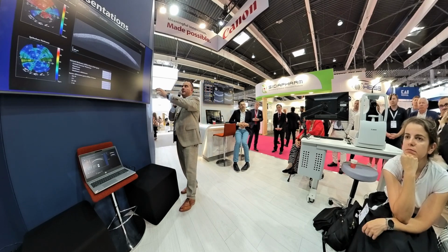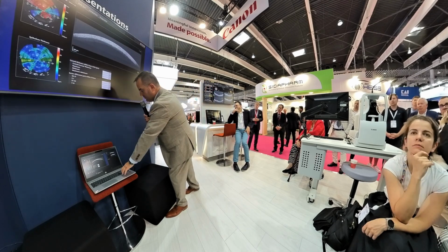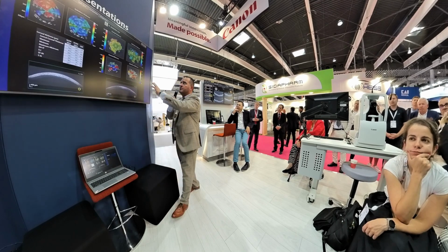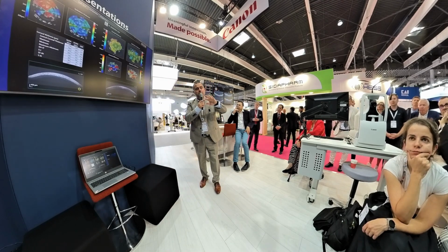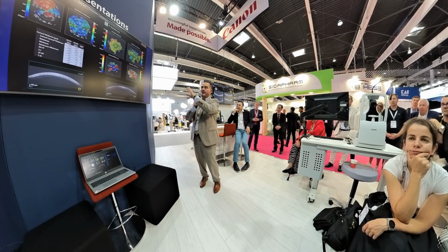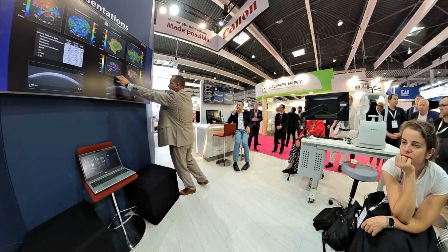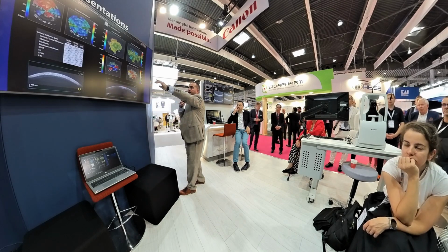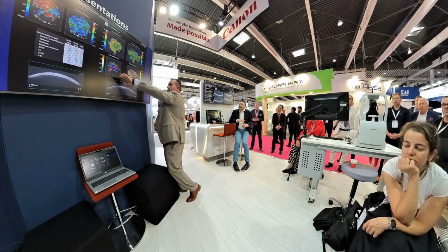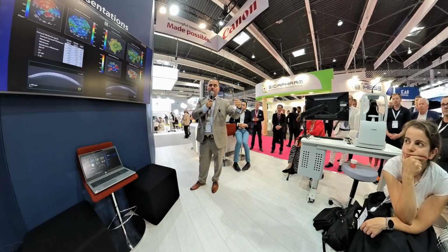Again, what is useful? Epithelium thickness maps and corneal thickness maps. Why are they useful? Because they can show if we are going in the right direction with our treatment or we are losing the battle with the necrosis. Because we can see that after the treatment and our attempts and efforts to save this eye, we have a reduction of the thickness, meaning that the cornea returns to normal function.